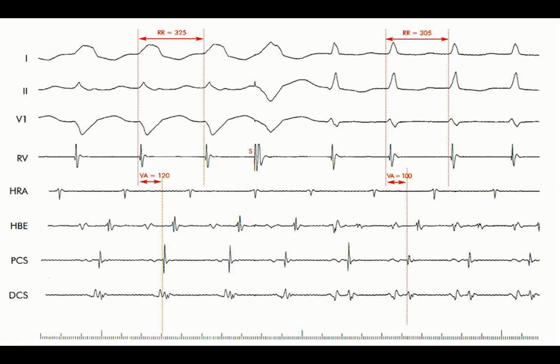Let's go to understand this concept in this example. At our right hand, we can see a narrow complex tachycardia with 1-to-1 conduction, and we can appreciate a septal VA of 100 milliseconds and a tachycardia cycle length of 305 milliseconds. At the left side, the patient developed a wide complex tachycardia, typical left bundle at V1, as we can see.